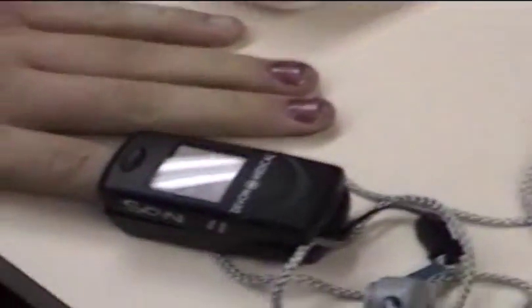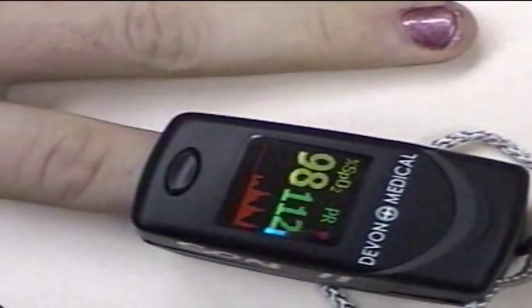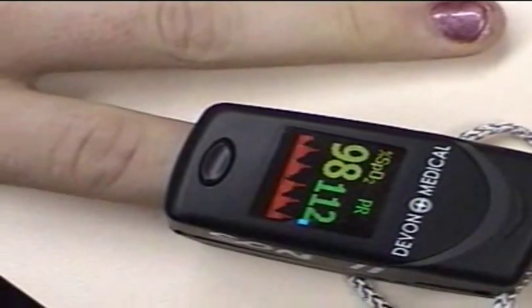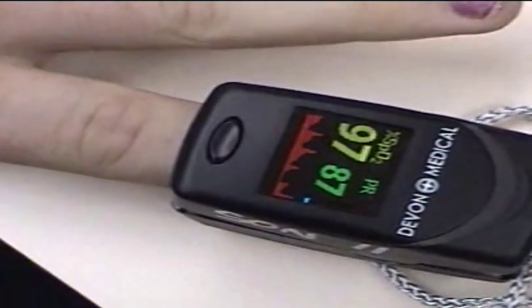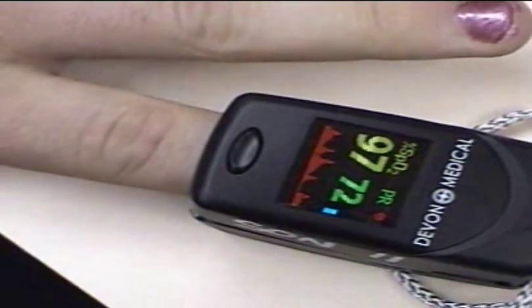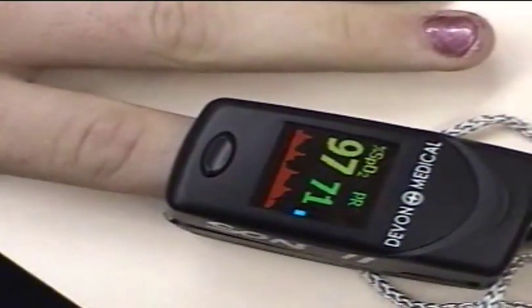Now this is the baseline. These guys are all tachycardic. Readings of 97, 98. He's okay. So that was the baseline.